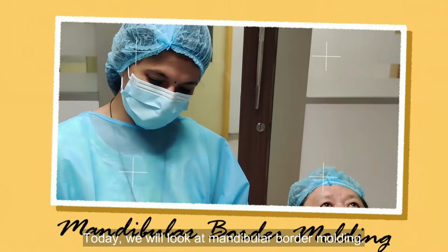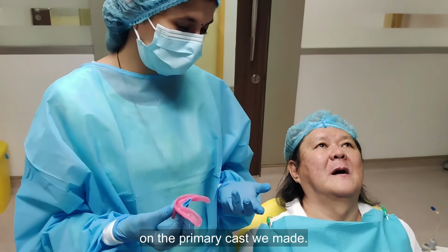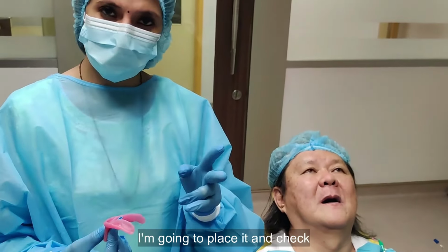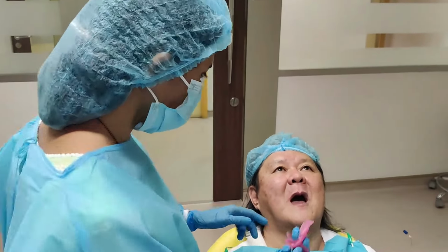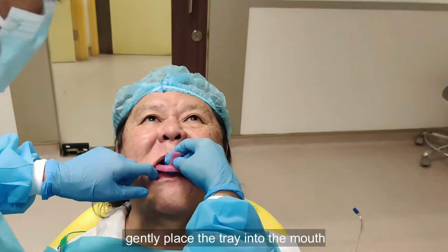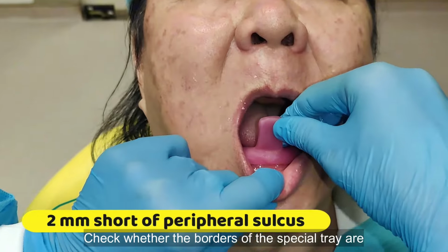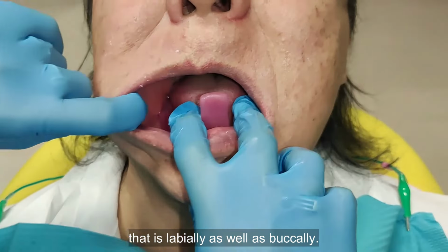Today we will look at mandibular border molding. So the special tray is ready with me after the primary impression and the primary cast are made. I'm going to place it and check whether it is 2 mm short of the peripheral sulcus. Stand in front of the patient and gently place the tray into the mouth. Check whether the borders of the special tray are 2 mm short throughout, that is labially as well as buccally.